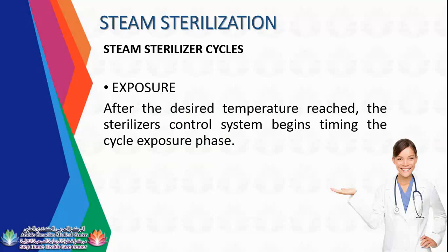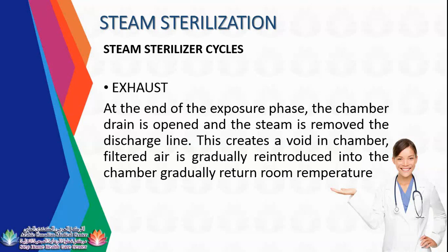Exhaust: at the end of the exposure phase, the chamber drain is open and the steam is removed. This creates a void in the chamber. Filtered air is gradually reintroduced into the chamber, gradually returned to room temperature. Actually, this is the room temperature, but it's still hot.